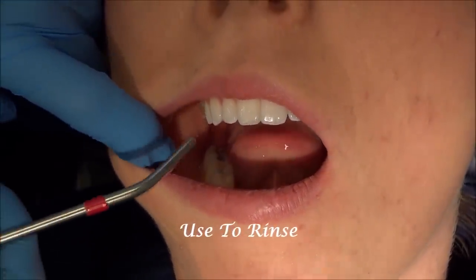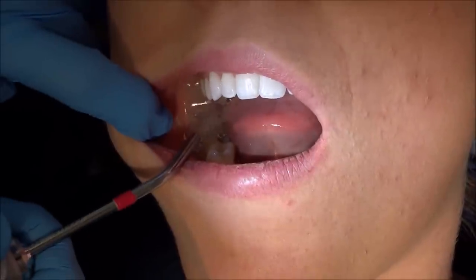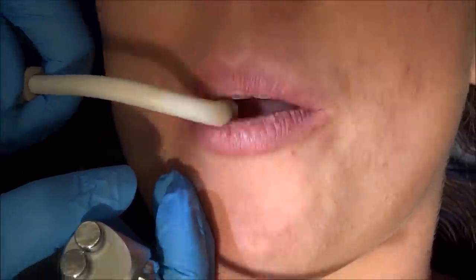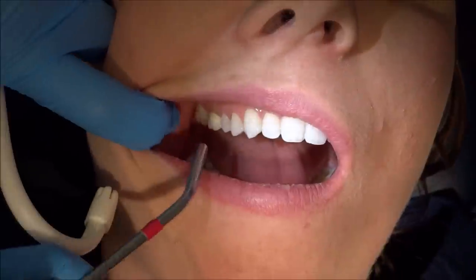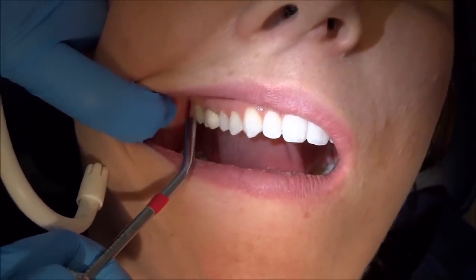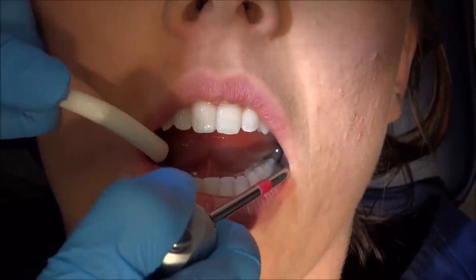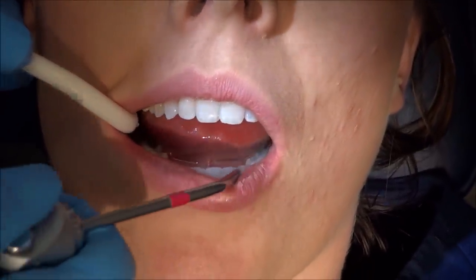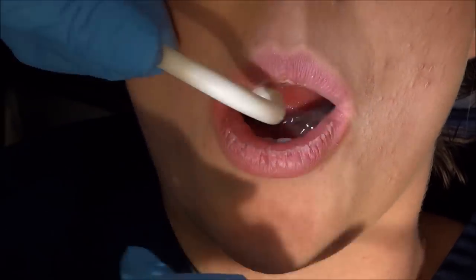Water alone can be used to rinse the patient. If the patient is sensitive to cold water, I'll usually fill up the back of the mouth with water so they can warm it, then have them swish. When they're ready, they can close their lips around the straw to rinse. I'll usually hold the water about three to five millimeters away from the tooth at about a 45-degree angle, keeping it close to the tooth so it doesn't spray out of the mouth.